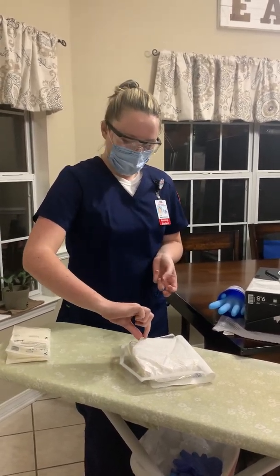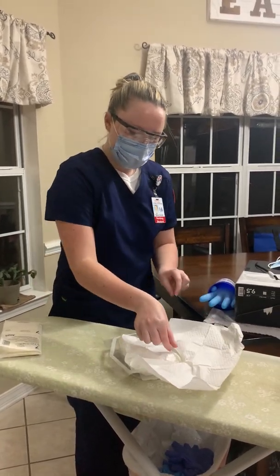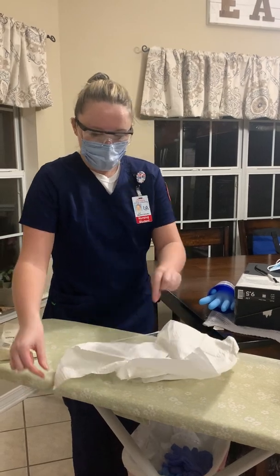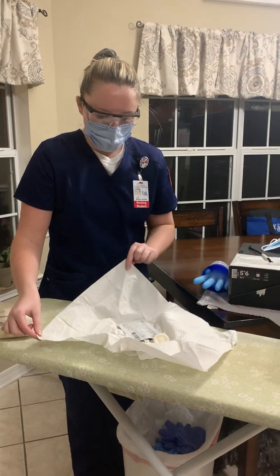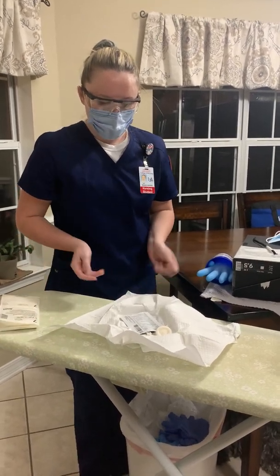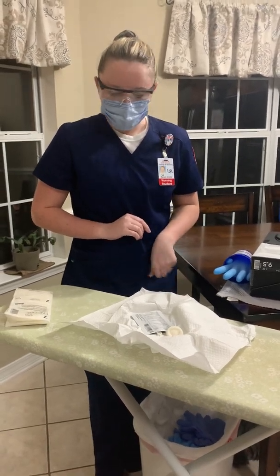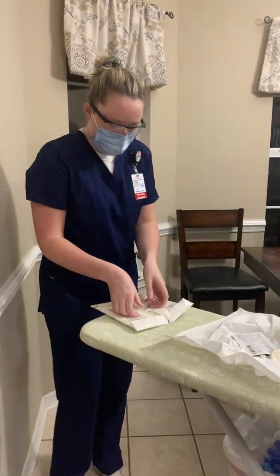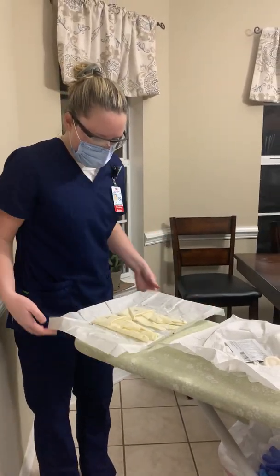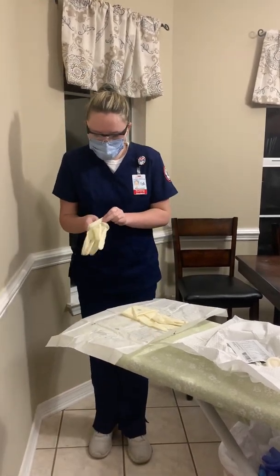And since I already have mine pre-packaged, I'm just going to open it, being careful of the 1-inch borders. And if I didn't have it already pre-packaged, I would lay my sterile field out, careful of the 1-inch borders, and I'm going to be careful of them now, making sure not to touch anything inside the 1-inch borders. So the next thing I'm going to do is put on my sterile gloves. So I'm going to come to the side over here. And I'm going to put them on.